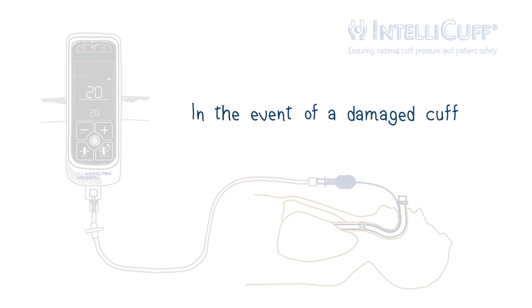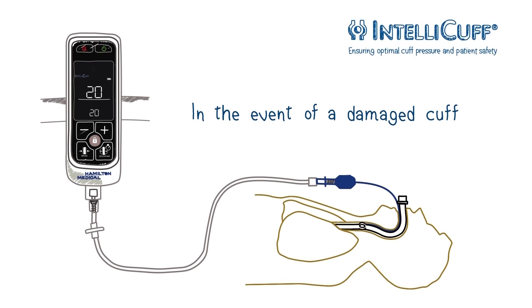In the event of a damaged cuff, the device generates an alarm while attempting to maintain the desired pressure. When appropriate, you can silence some alarms while you remedy the situation.